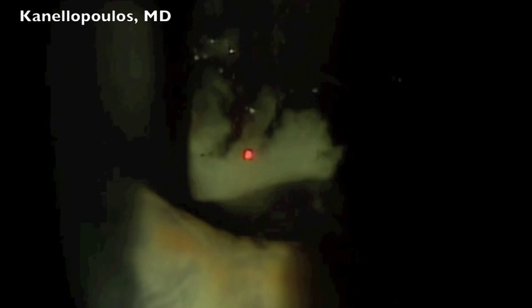as this procedure several decades ago would obviously demand a re-op in the operating room and manual cleaning of the posterior capsule. So we're going here slowly and methodically to clear the central part of the lens, and you can see how effective posterior capsule YAG incision is in today's technology.